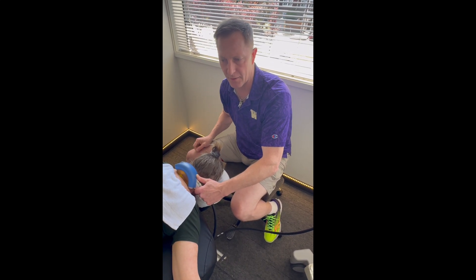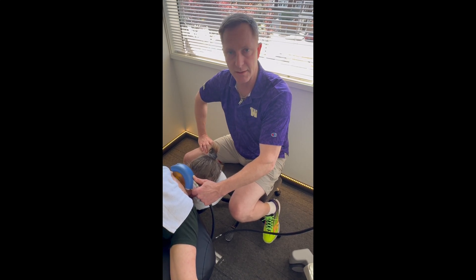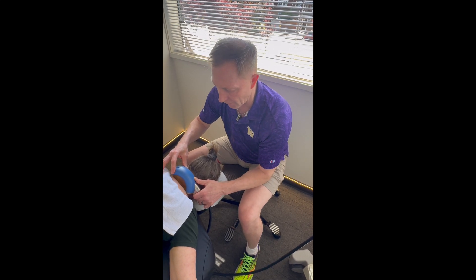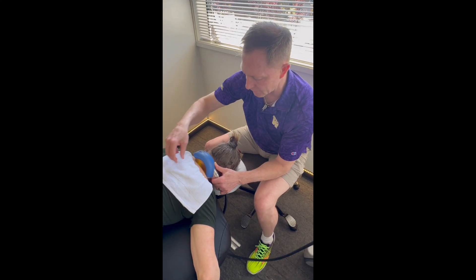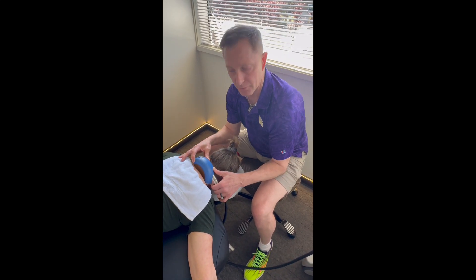This is the same piezo wave technology used for lithotripsy — to break up calcium stones in the ureter or the kidney. So it's effective. She's feeling relief coming down the spine — she can feel it shooting down. Right there — so she feels it coming down, and that's exactly what we're looking for.